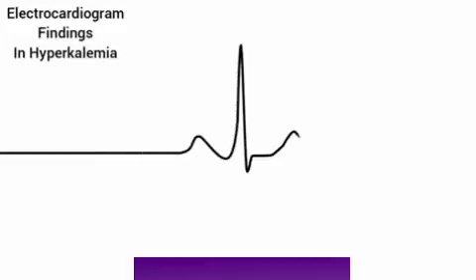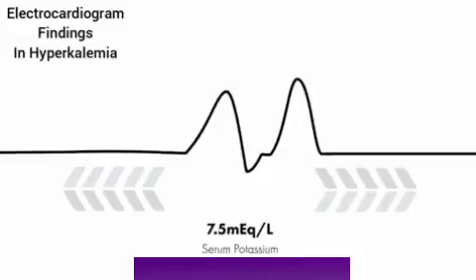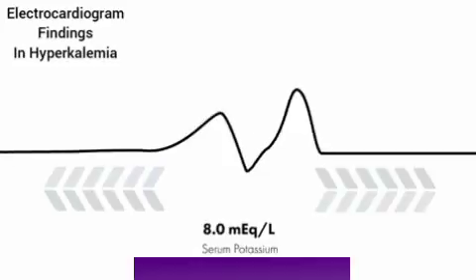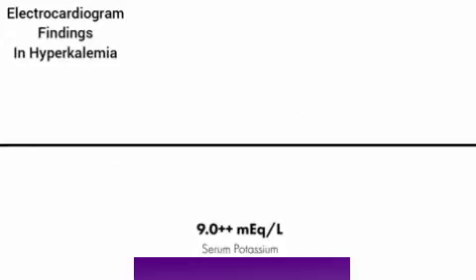One helpful way that the effects of hyperkalemia were described to me as a student was to think of the EKG strip as a string, and imagining someone pulling the ends of that string outward, with the severity of the hyperkalemia being directly correlated with the extent of how far the string is being pulled, until the string is pulled flat and the patient is in asystole or cardiac arrest.